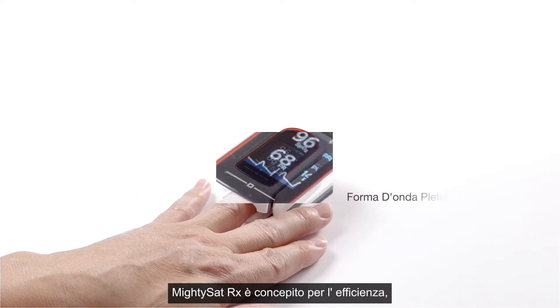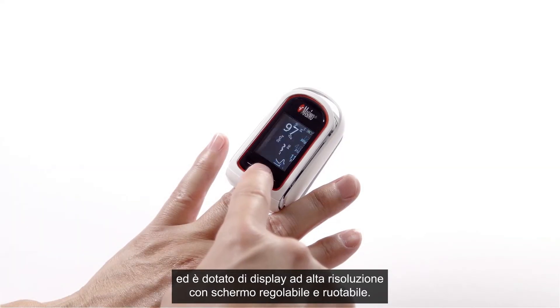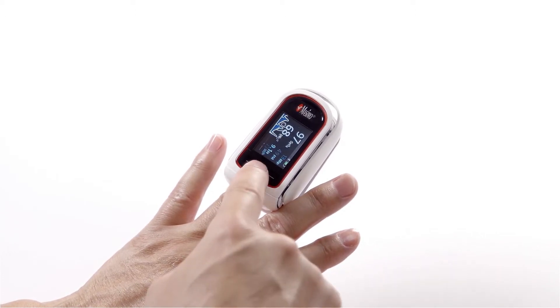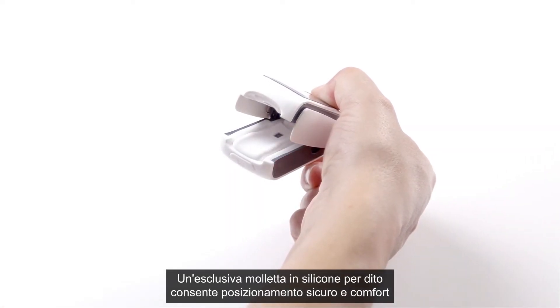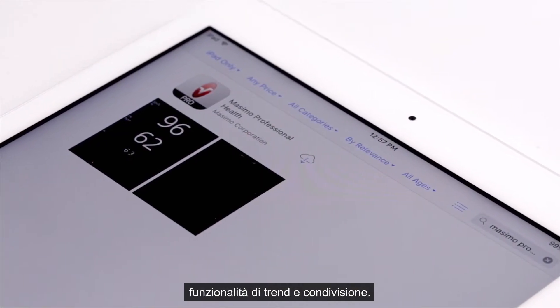MightySat RX is designed for performance, featuring a plethysmographic waveform, a high-resolution display with a rotating and adjustable color screen, a unique silicone finger grip for secure placement and enhanced comfort, and a free downloadable Masimo Professional Health app with trend and sharing capabilities.